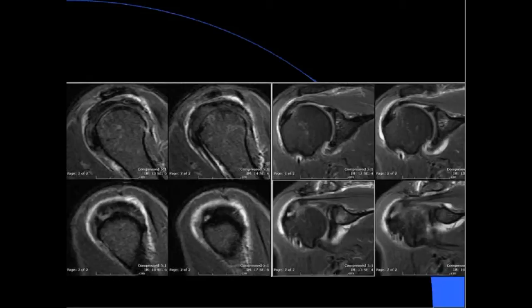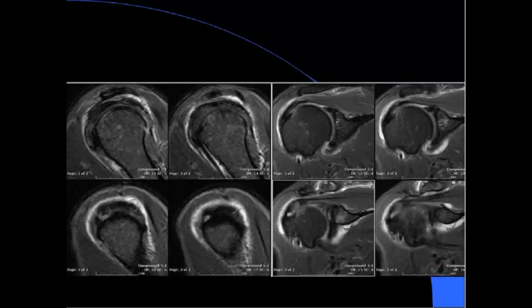It's a partial tear. More specifically, it is a rim-rent tear. A rim-rent tear is just a fancy name for an articular surface tear at the footprint of the inner aspect of the supraspinatus. Some people call it PASTA lesions, but if you said this is an articular surface tear, that is good enough. Just a couple of things about tendinopathy and tears.